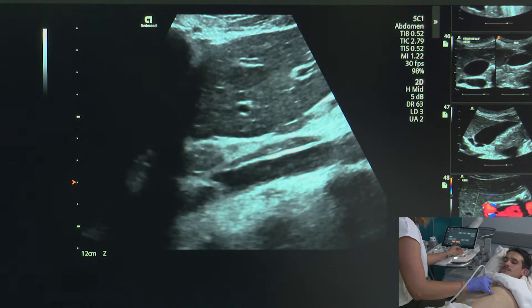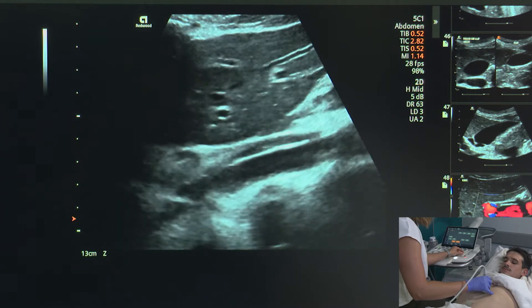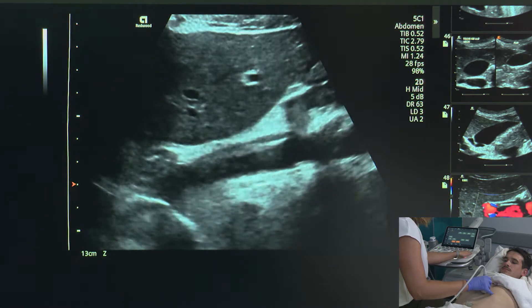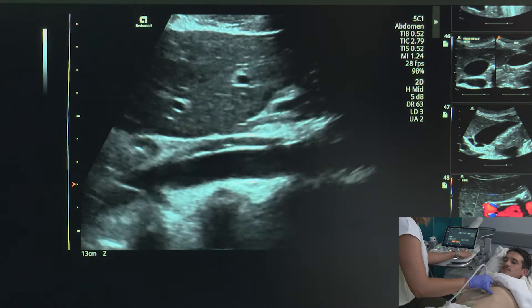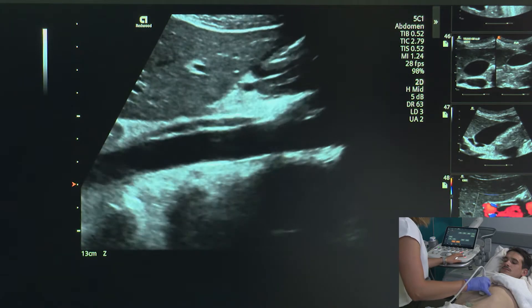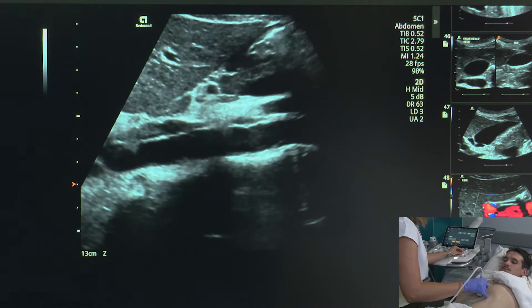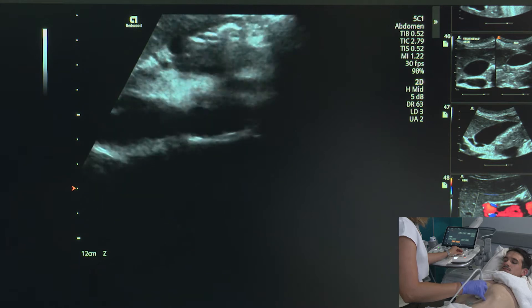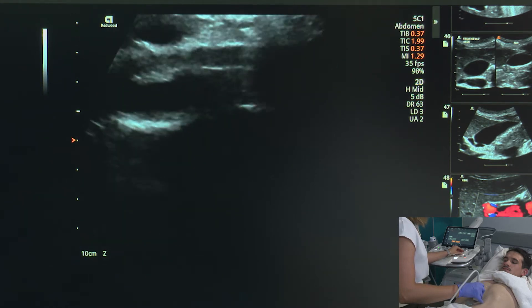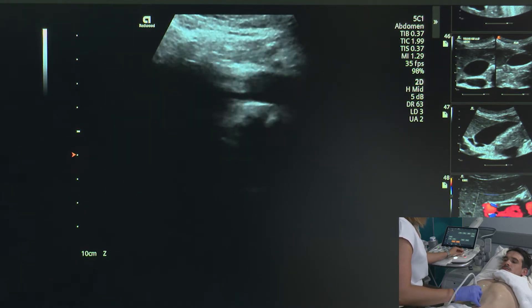We adjust our image by adjusting our depth, zoom, and moving our focus so it's posterior to the aorta. We want to make sure that our time gain compensation is set appropriately so that we don't have too much reverb within the aorta. As we scan, we want to do these mini sweeps through the aorta to make sure that there's nothing hanging off those sides of the walls as we make our way down. You just kind of have to sit through some bowel gas as we make our way through the midline.